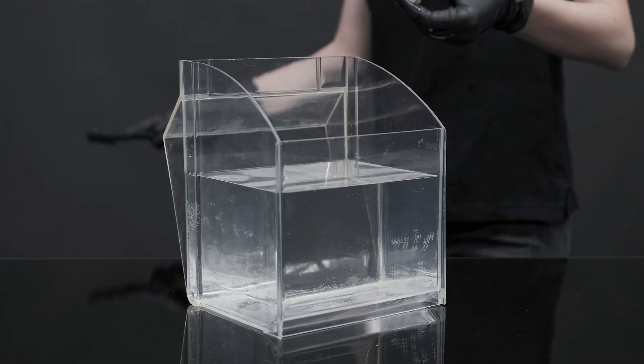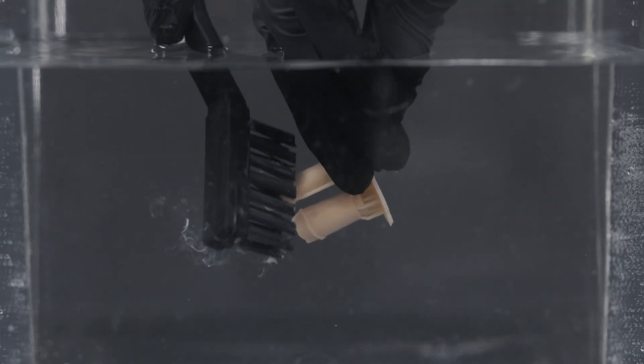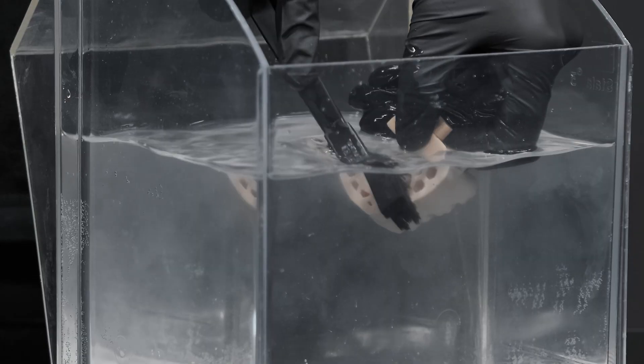In a washing up bowl full of water, clean the model with a soft bristle brush until its surface is completely clean. In case of hollow models, clean also the inner parts.